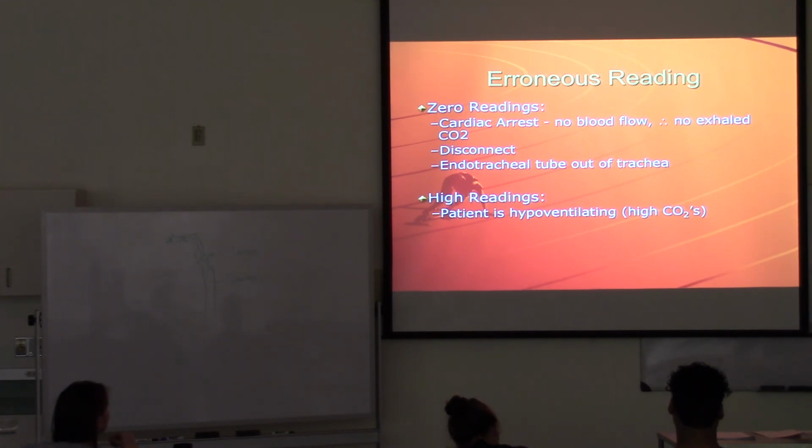All of the above. Would you pick all of the above? The CO2s went from 35 to 40 to 45. Does that mean the monitor or the adapter got wet? Or does that mean that the patient's hypoventilating and now we're not getting rid of their CO2? Hypoventilating, so 2 only. Yes, 2 only.